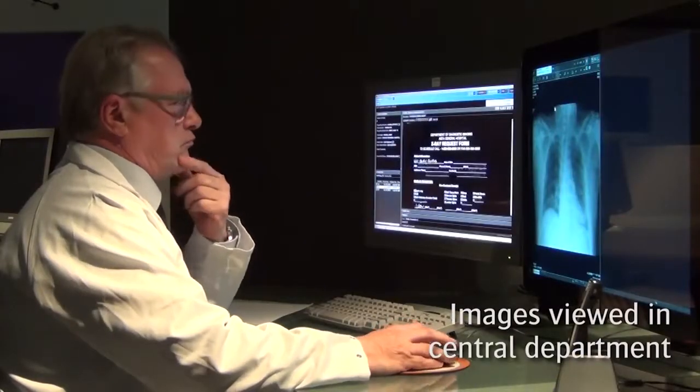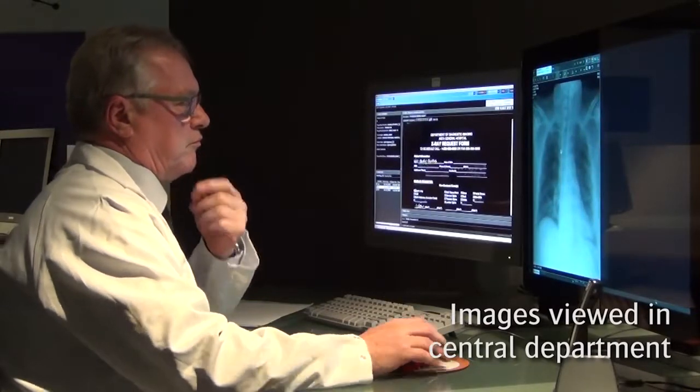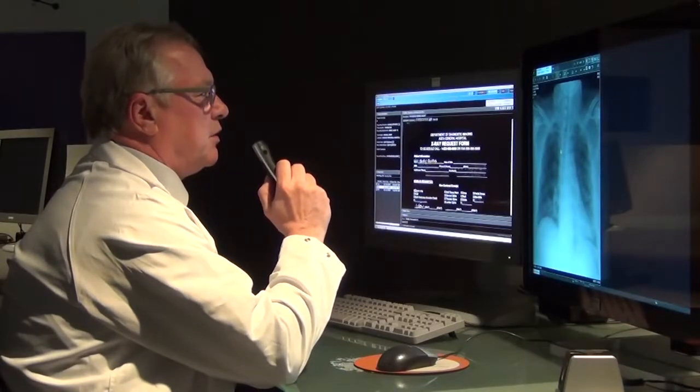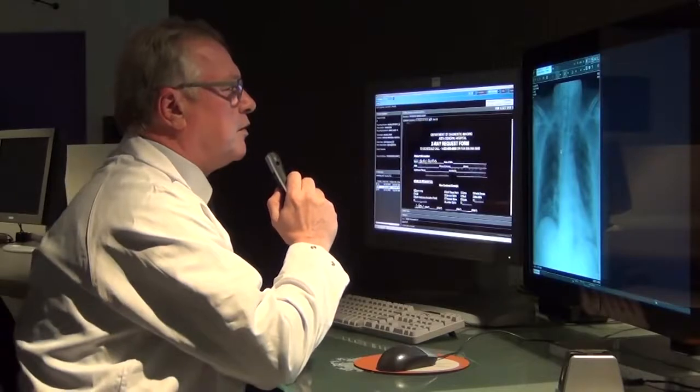In the central department, the radiologist can view the images from the mobile unit shortly after the examination was performed. Once the radiologist has completed the diagnostic report, it can be sent to the general practitioner.